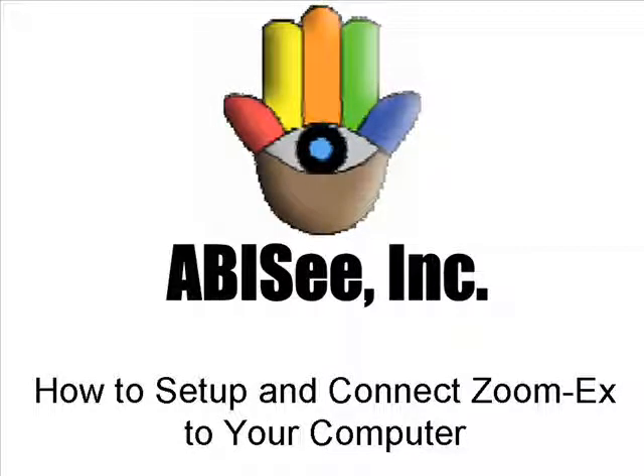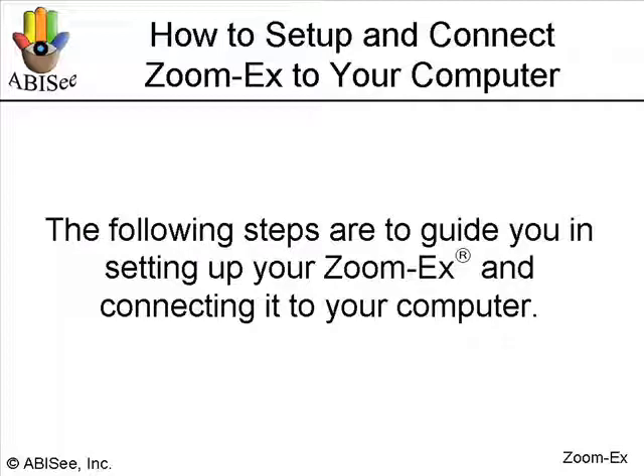How to set up and connect Zoom-Ex to your computer. The following steps are to guide you in setting up your Zoom-Ex and connecting it to your computer.